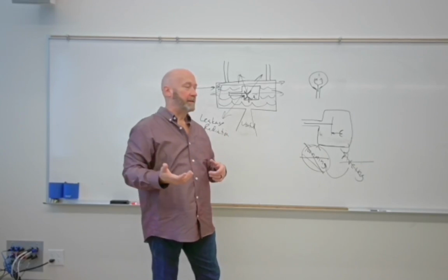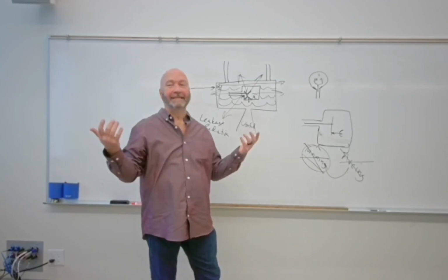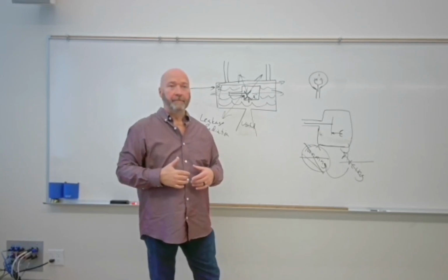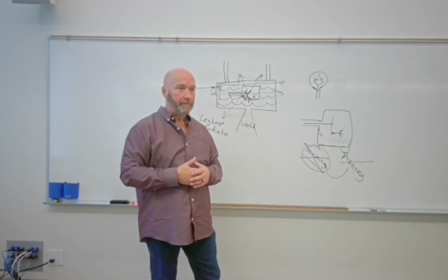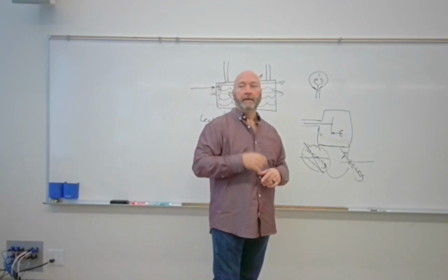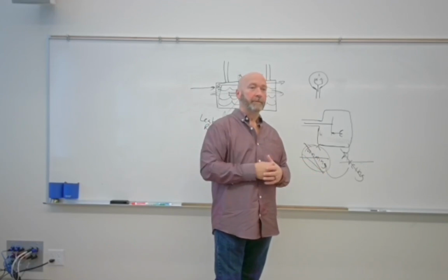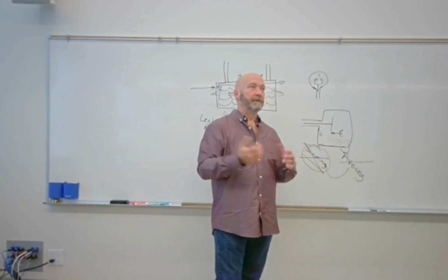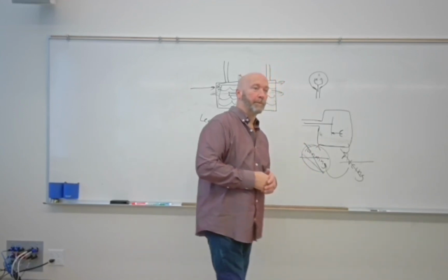If you've got a machine that gives you a tube overload light, and you're setting a technique of maybe 60 kVp at 100 mA station with a low time, and it's still giving you tube overload on either large or small filament, just individually one at a time, that filament's burnt out, right? If it'll allow you to make the exposure on the other filament, that's definitive proof you've got a burnout filament. And then again, unless you know your radiologists are okay with that single other filament, that's another tube replacement.